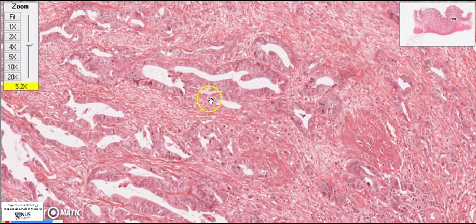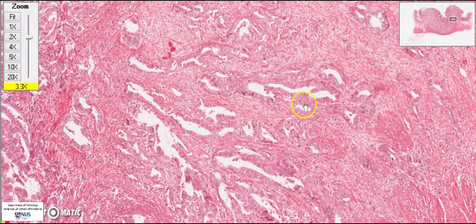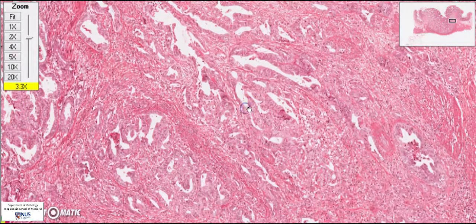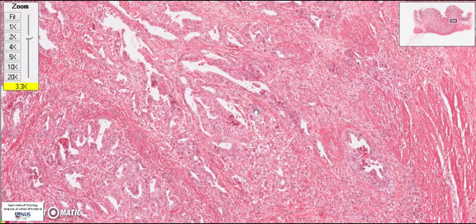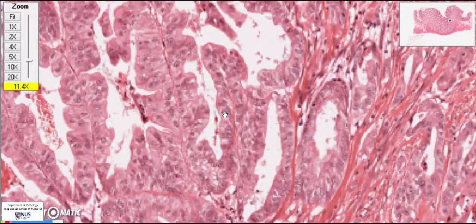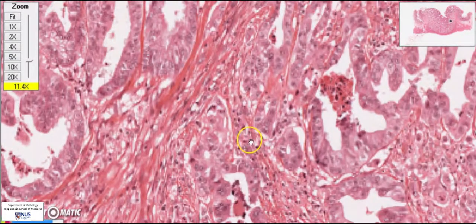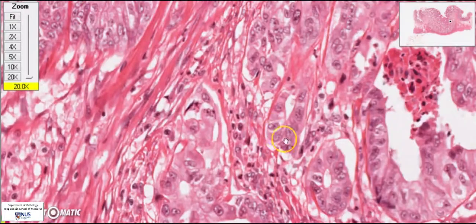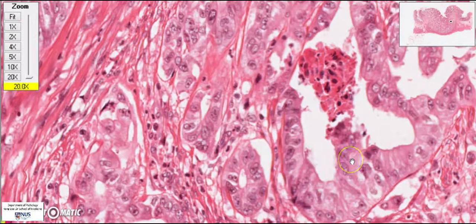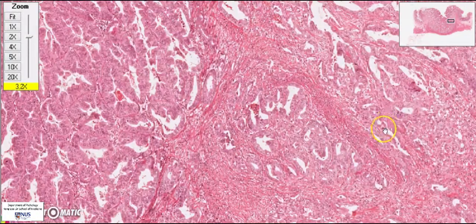The next thing we want to do is grade this tumor. Grading is done histologically by looking at the architecture — is it gland-forming? We know it's an adenocarcinoma because it is obviously forming glands, so this would not fall into the poorly differentiated or undifferentiated grade. Looking at the cytomorphology, the cells are pretty pleomorphic — too pleomorphic to fall into well-differentiated. Therefore, this is most likely a moderately differentiated adenocarcinoma, intestinal type.